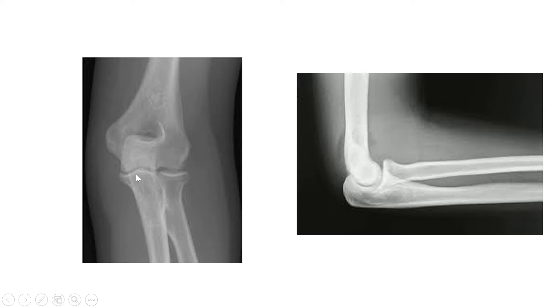In this joint we see that there are three bones: this is the lower end of the humerus, this is the upper end of the ulna, and this is the upper end of the radius.